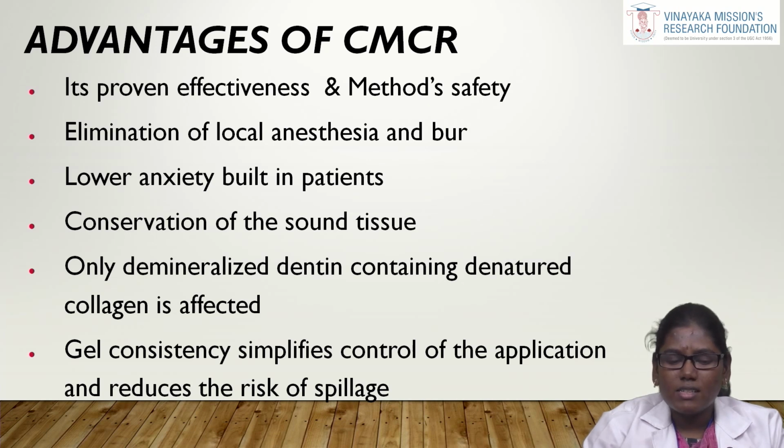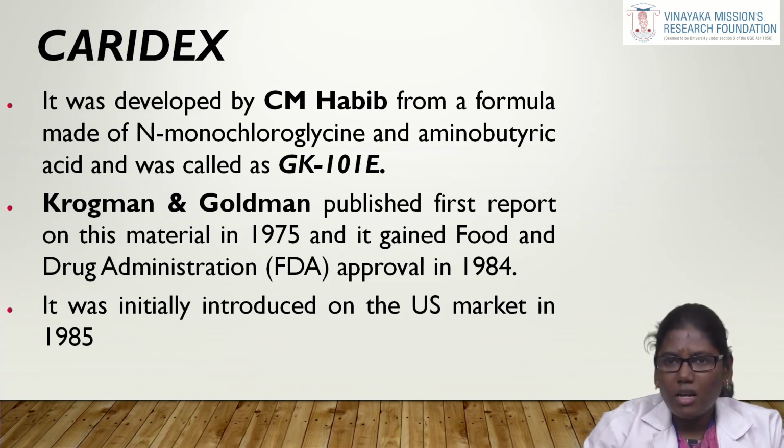Because of its gel consistency, it simplifies application on the tooth structures and reduces the risk of spillage while applying to the tooth surface, which is more comfortable for pediatric patients. And these are some of the chemomechanical caries removal agents.